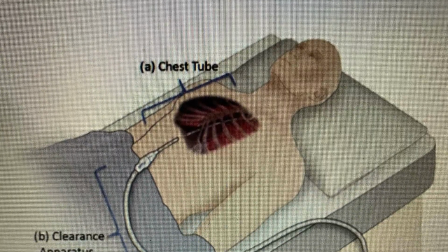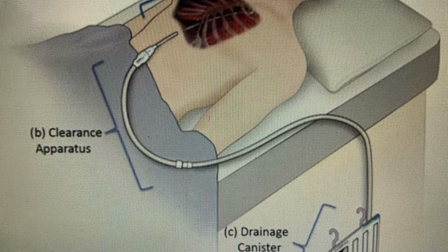This is placed under the sternum and drains fluid from around the heart after cardiac surgery.